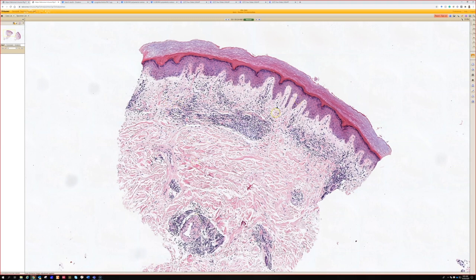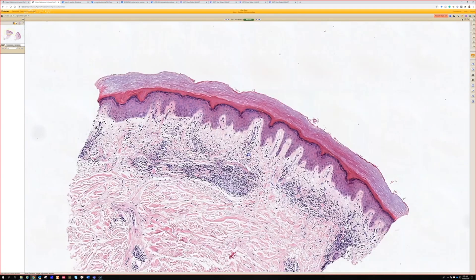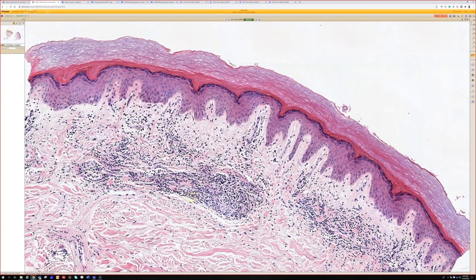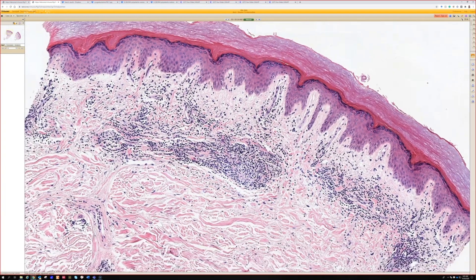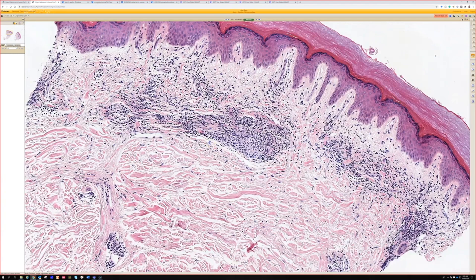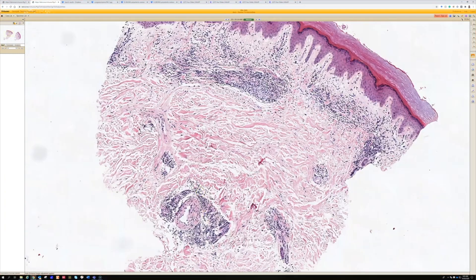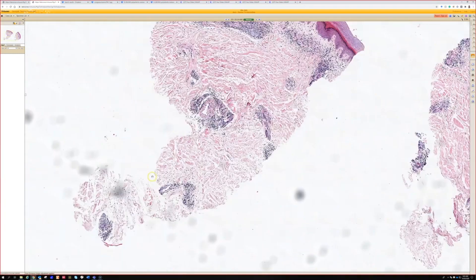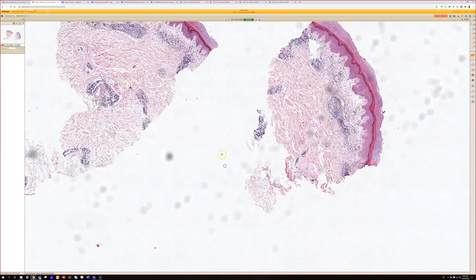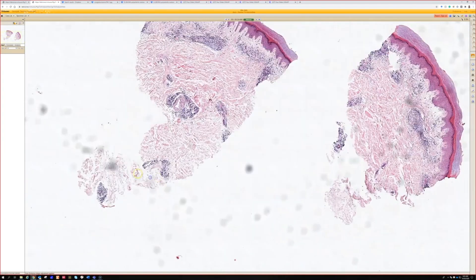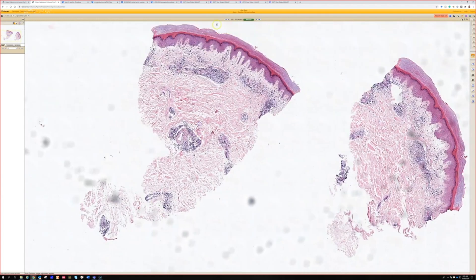If it looks like PMLE but it's on acral skin, then think about perniosis. Sometimes there's a little bit of hemorrhage, because some people think this is a form of lymphocytic vasculitis where you get vessel damage. I also often find lymphocytes around the eccrine coils in perniosis — I've seen that multiple times.